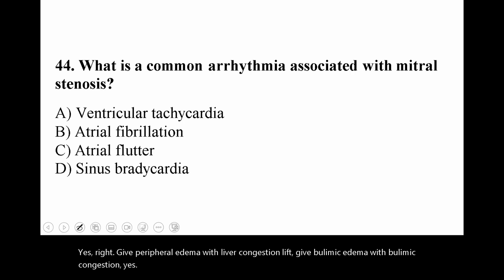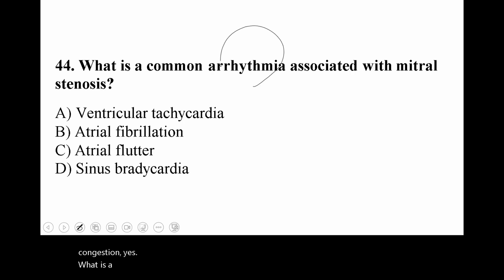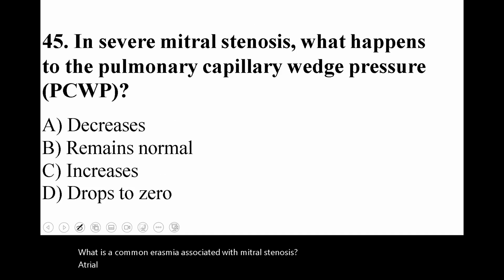What is a common arrhythmia associated with mitral stenosis? Atrial fibrillation, yes. Last one, in severe mitral stenosis, what happened with pulmonary capillary wedge pressure?